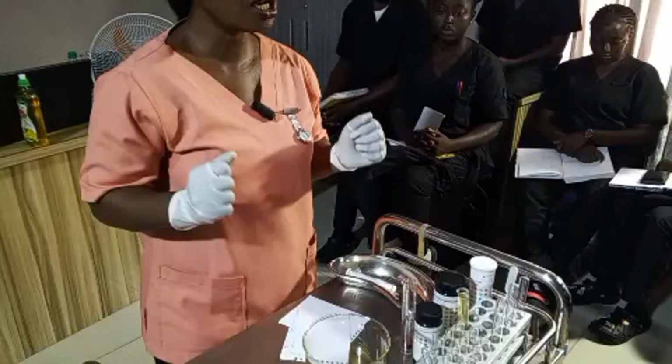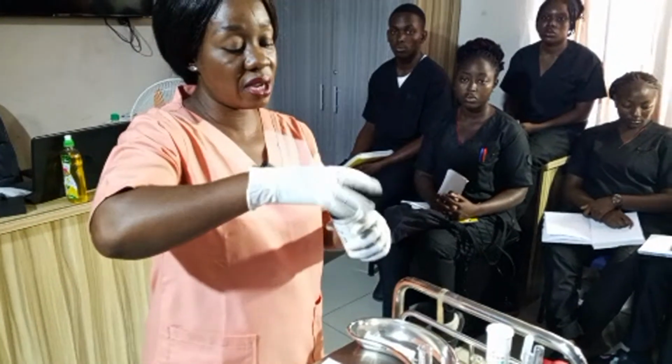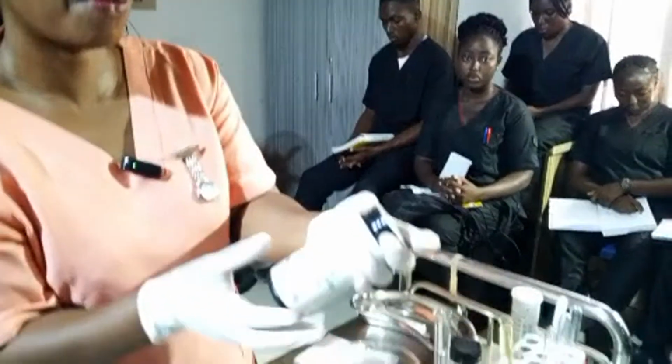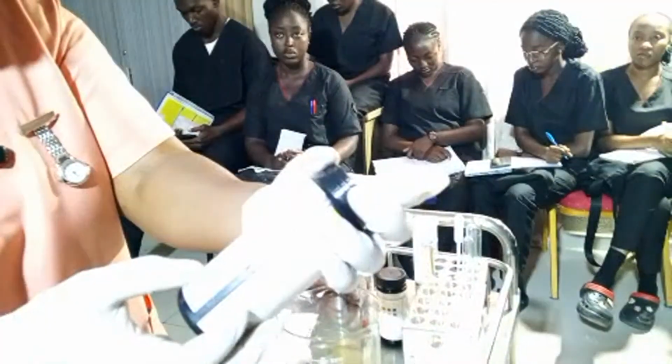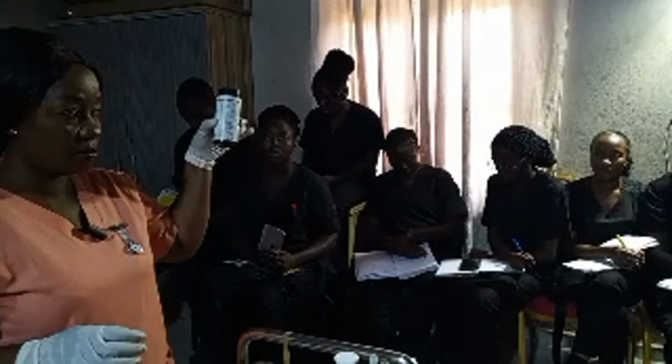Right? After getting this, you open the Combi 9. We are going to use Combi 9, right? Remember, if you are using this, it's new. I haven't opened it before. I haven't used it. So you have to first of all check the expiration date. For this, it hasn't expired. It will expire March 2025. So check the expiration date on the container. It hasn't expired, so it's good to go, isn't it?